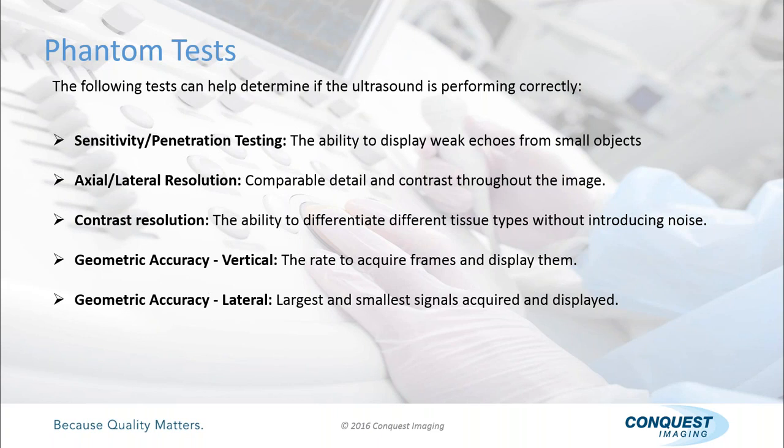And as we look at phantoms later, you'll see that there are some very small objects, and it's important for us to look at what depth we can see those at. Because clearly the way we want to do this is find an irregular cyst at the very earliest time. So the ability to resolve that early at as deep as possible is clearly the way to go. So we'll talk more about that.